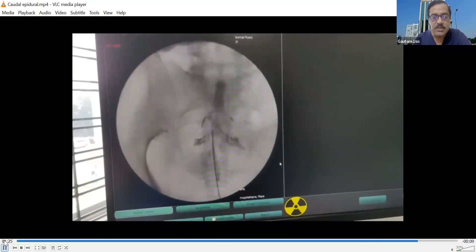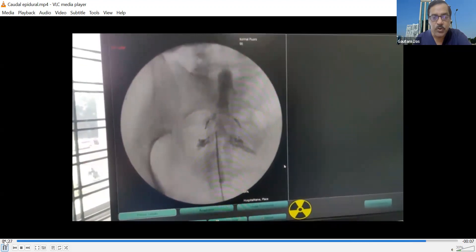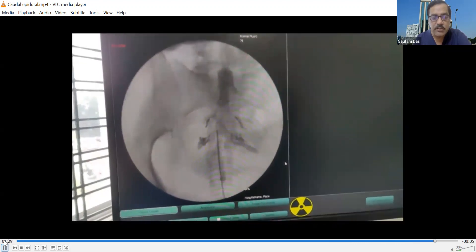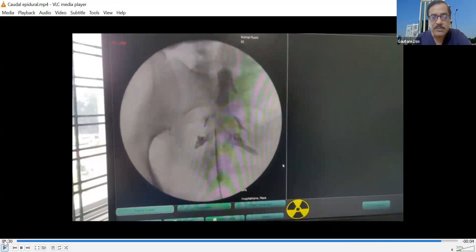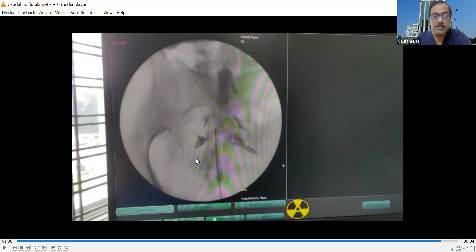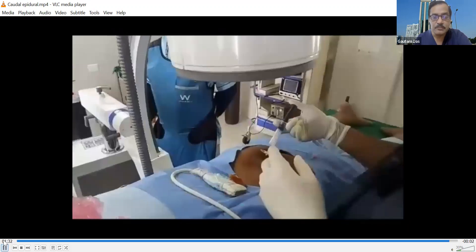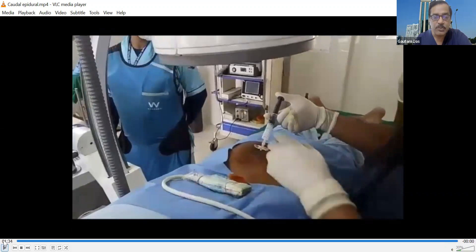Dye is injected under continuous fluoroscopy to confirm the dye is not taken up by the vessels. It is a beautiful inverted Christmas tree appearance — you can see the sacral nerve roots with a heterogeneous appearance, and there is no vascular uptake; the dye is not vanishing. We are happy with the dye spread, and we are injecting around 10cc of a 40mg triamcinolone and local anesthetic mixture. That ends the procedure. Thank you.